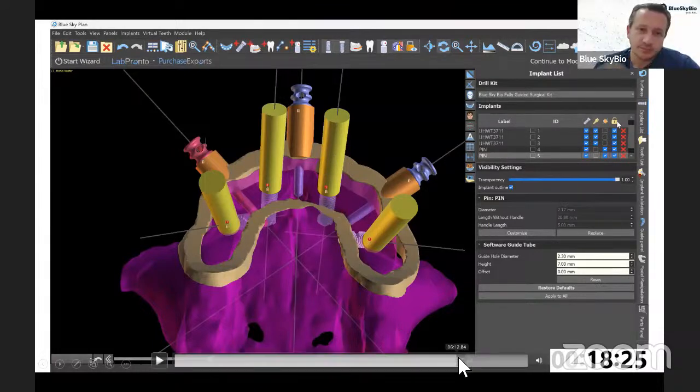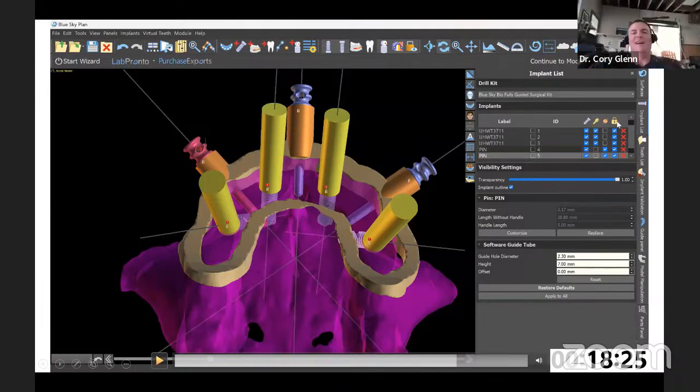Okay. All right. So I'll quit picking on you, but the reason I bring that up is I can't tell you how many hoops I used to jump through of doing all this Boolean stuff and trying to figure out a way to get around this. And the solution was so simple, as these things usually are.